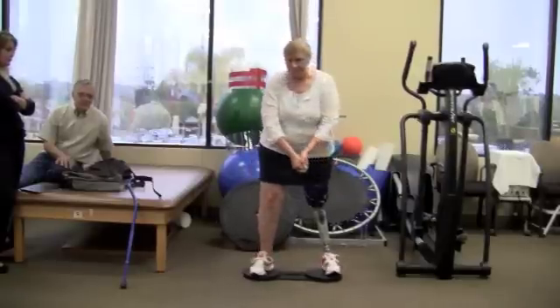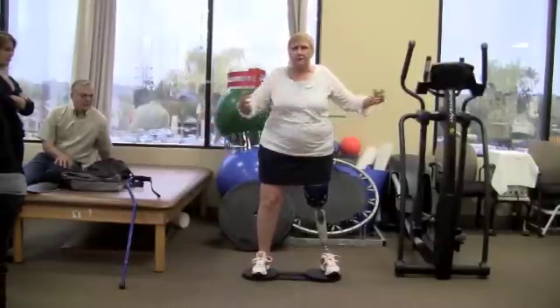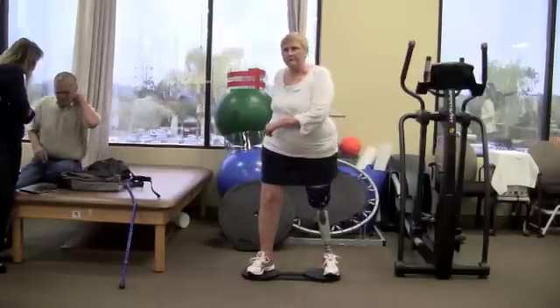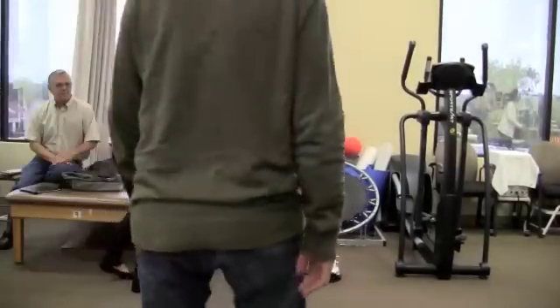The other thing that's so great about the 8-board is how compact and light it is. And it's very inexpensive, especially in our industry. Therapy has limited visits and the 8-board used at home continues improvement at the patient's pace. We love the 8-board.